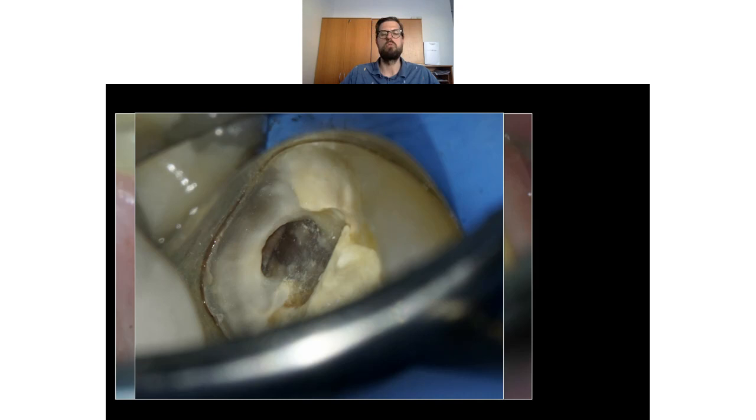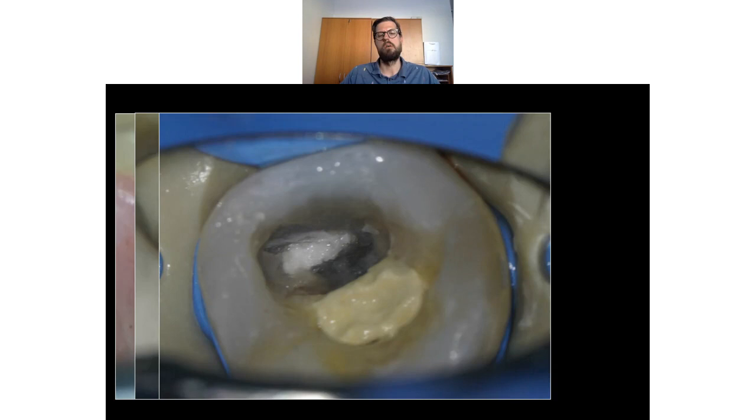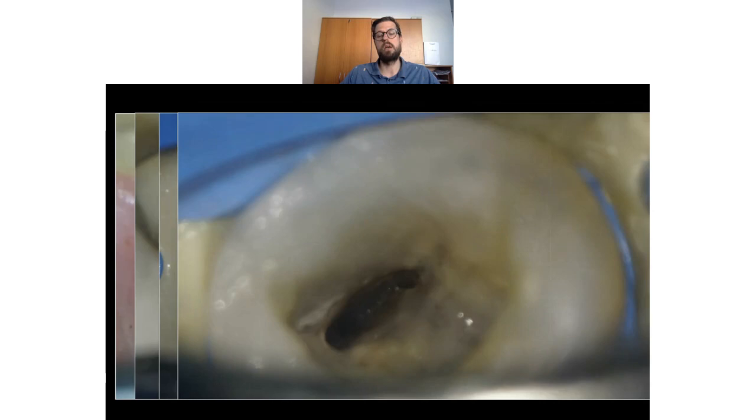So as we done the pre-endo, I covered my entrance to the distal with Teflon tape. So you just remove it, and as you have the time with no moisture, no saliva coming inside, then you can look also at the other aspects, not only the mesiolingual, and you see that there's another canal in the distal part. So the doctor found only the distal lingual, but the distal buccal she didn't find. So I took my phone and phoned her, and I said, okay, there's not only a problem with the mesiolingual, but there are four canals that should be treated. And she said, okay, do all the work, because I see that it's a little bit too difficult.